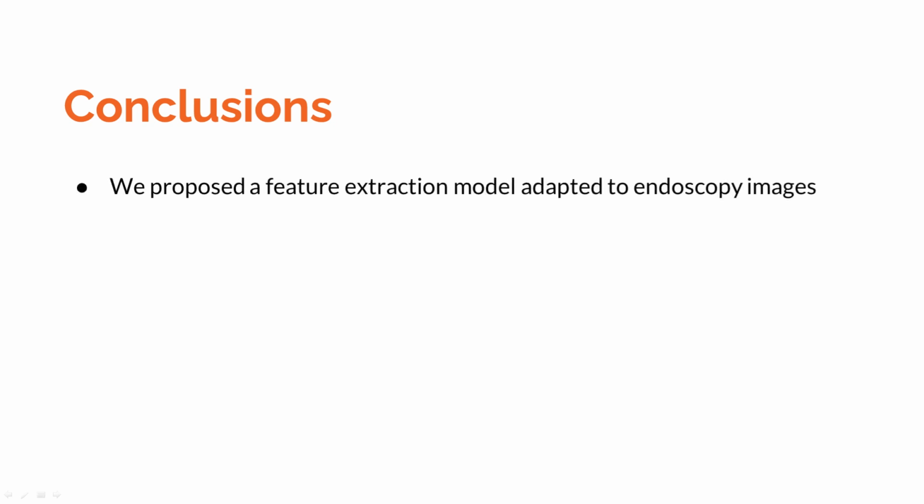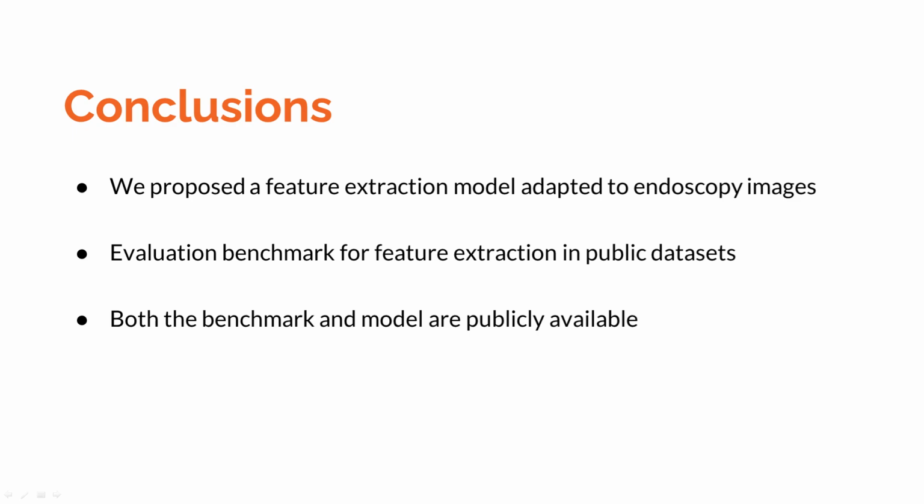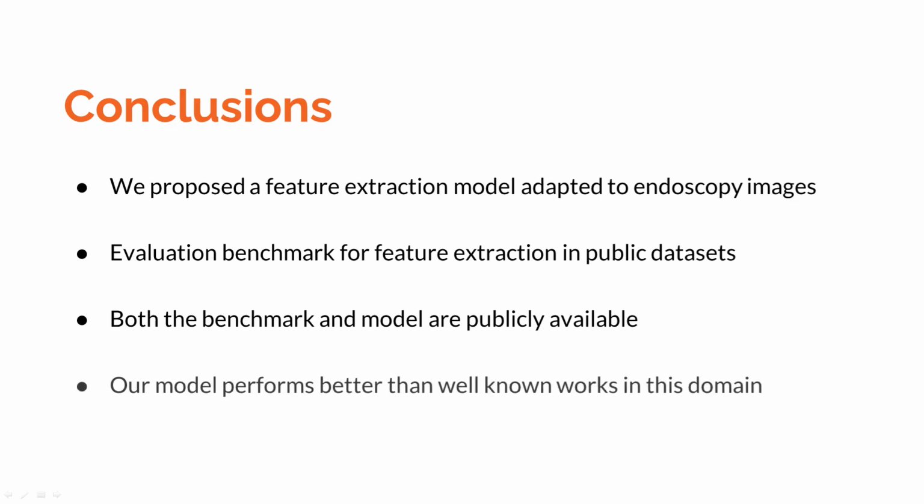As conclusions, we proposed a feature extraction model adapted to endoscopy images. We designed an evaluation benchmark for other models to be compared against it, and released both of them to the community to use. Additionally, our model performs better in this domain than other well-known methods.